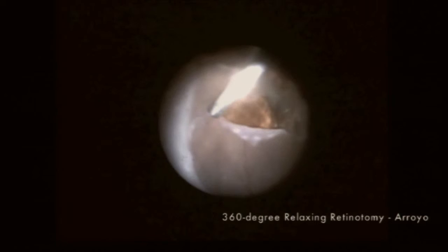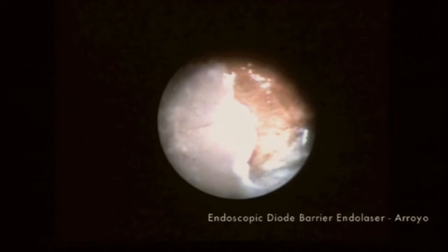Fluorocarbon oil tamponade was used to reattach the retina, followed by diode laser endophotocoagulation treatment at the edges. I found the endoscope to be particularly helpful in the fluid-air exchange, where the view is excellent while all subretinal fluid is removed. Finally, you have the endoscopic view of silicone oil placement.